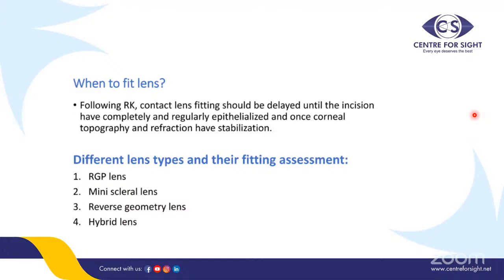So once you have stable topography and refraction, only then can you take into account the topography and plan a contact lens fitting. There are different types of lenses available. There are RGP lenses, mini scleral lenses, reverse geometry lenses, and hybrid lenses available.